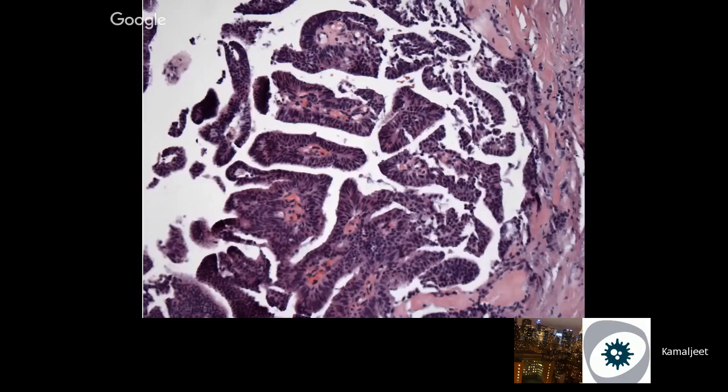Now papillary DCIS. Papillary DCIS will strike you as a papillary lesion. How would you pick it? It will look like the papillary cores are thin, usually. They're not sclerosed. And the proliferation involving the papillary cores is comprised of elongated cells. They are overlapping. There are no myoepithelial cells. It almost looks like a villous adenoma. And it's actually rare. It's one of the rare forms of DCIS. So before you make a diagnosis of papillary DCIS in boards or in general practice, just think, are you looking at a papilloma with DCIS? Because that's far more common than true papillary DCIS.